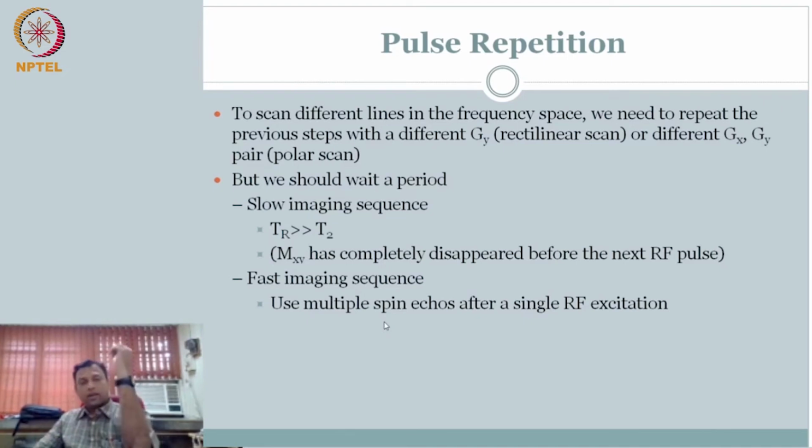The whole idea is I'm getting the signal from a volume, from a slice thickness. How did we do that? We applied a Z gradient. Not only that, if you only apply the Z gradient, you don't get signal because it is all cancelling. We applied a polarity switch for a short duration. So we made what is called a refocusing pulse in the Z gradient. Why did we do that? When you do the refocusing, it will focus back and the signal will start to appear.